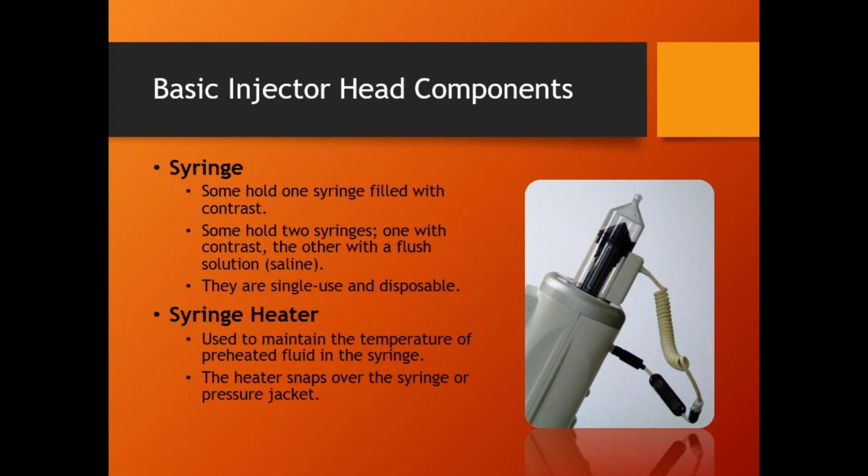What's that? Yeah, you can't fix them. I mean, there's one component in here, and I don't know what makes it go bad, just time, I guess. But when it dies, this little light right here goes red. You have to toss it out. You can't repair it. You just have to buy a new one. $1,300. Whew.